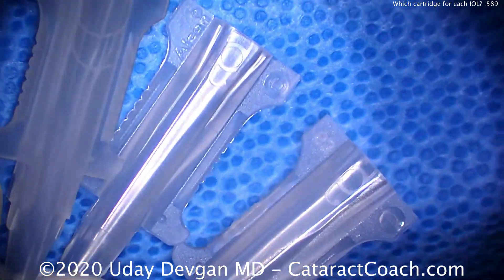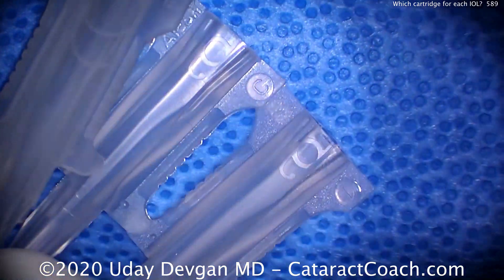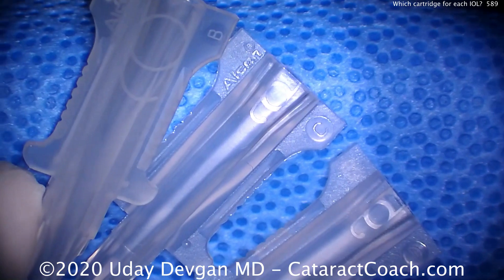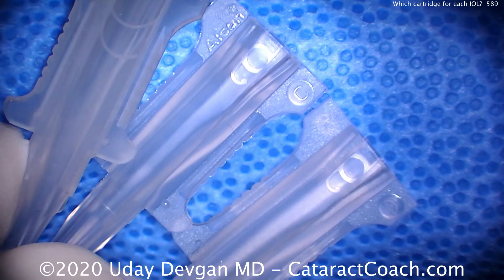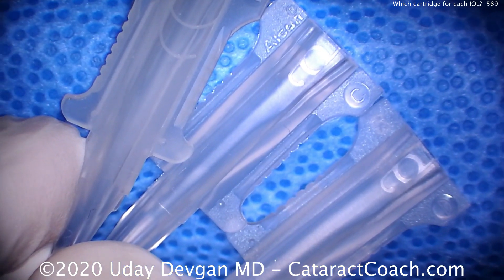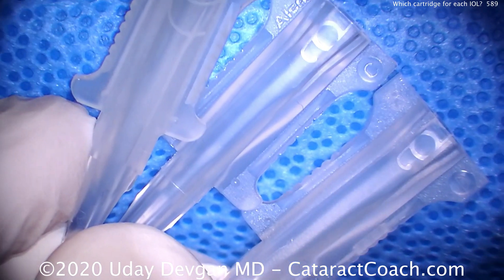Here are the three cartridges, held in one hand, and you can see they all look very similar: B, C, and D. But there are some crucial differences. You can see just by looking at the picture, the B cartridge has a picture of a three-piece lens on it, whereas the C and D cartridges have a picture of a single-piece acrylic lens on it.